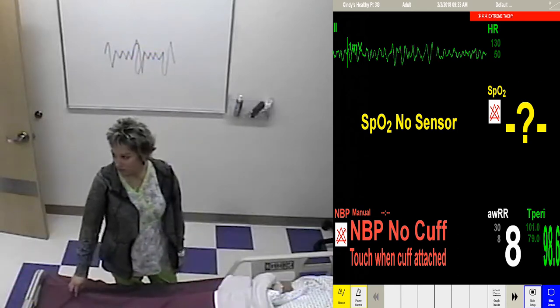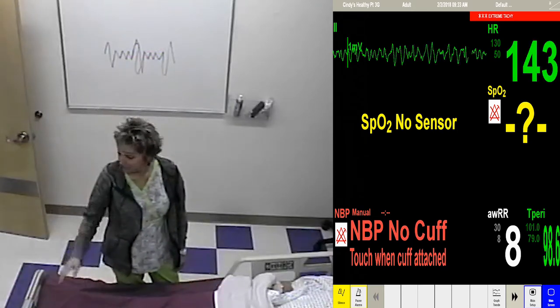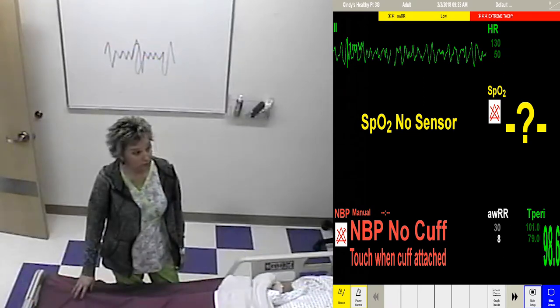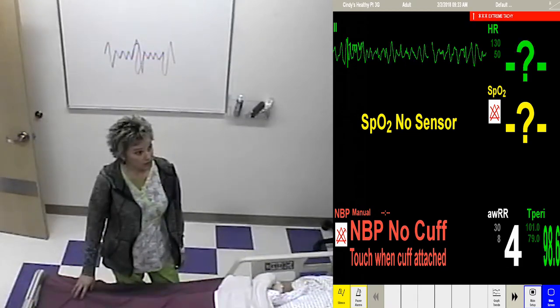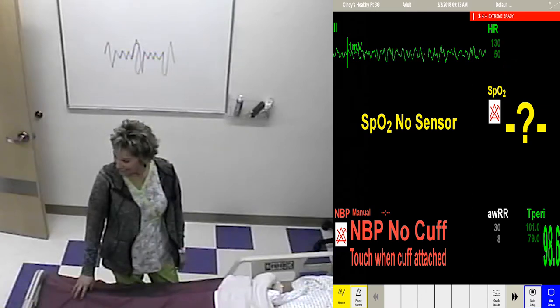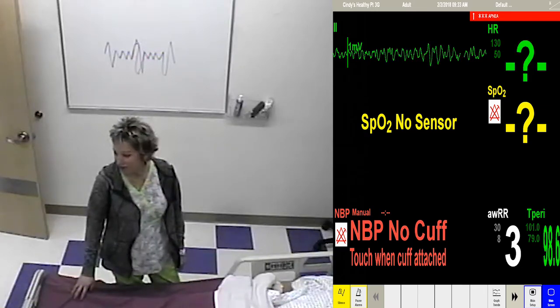Are there P waves? I have no idea. Are there QRS waves? Yes. Are there T waves? I don't know. Is there a P before every QRS? Unsure. Or is there a T after every QRS? I don't know.